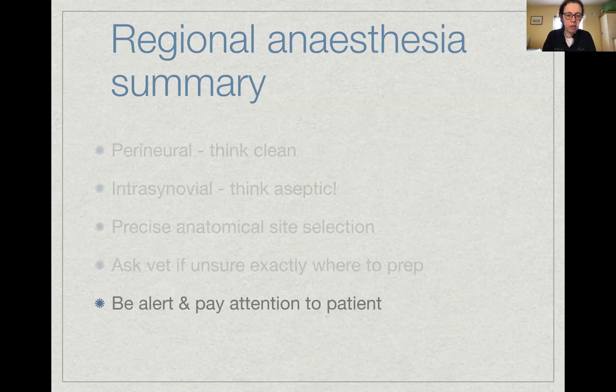Often we're doing these procedures on animals who are conscious and often not sedated. So it is important to pay attention if you're holding the animal while someone else is putting needles in their legs. Watch out for that and don't just look out the window or look at your phone and not restrain them properly. Likewise, if you're the person placing the needles, make sure your colleague is paying attention and that you warn them when you're about to do it so that they can be on alert.